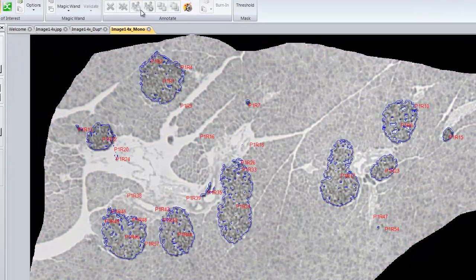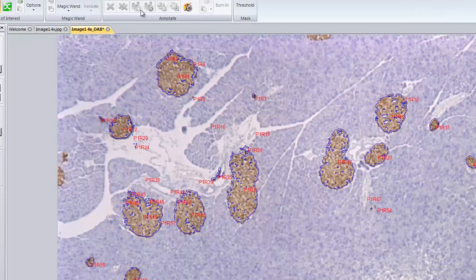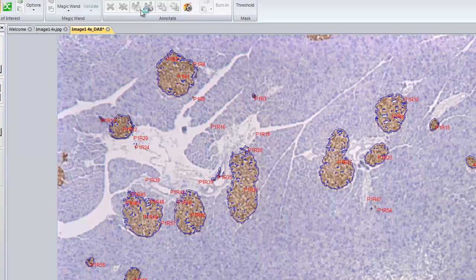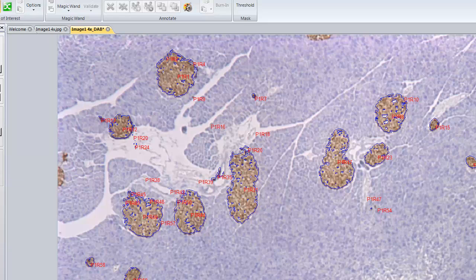It's going through measuring just within that region of interest, create a new image based upon that. And now as I've selected that option to create and save the annotated image, it's now created and saved that annotated section or region of interest.